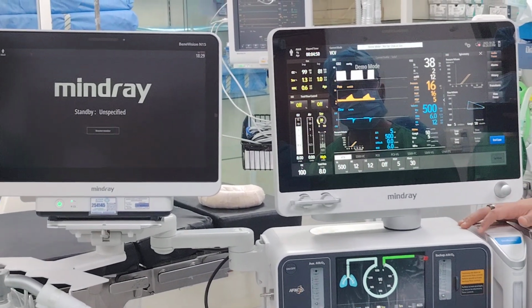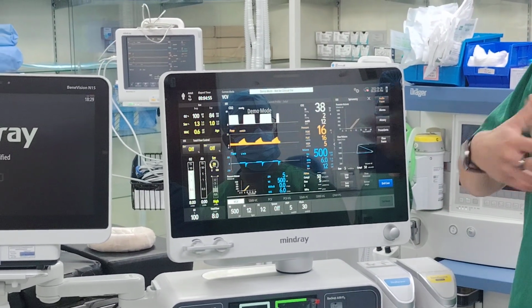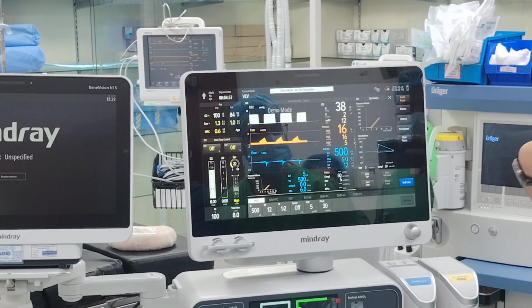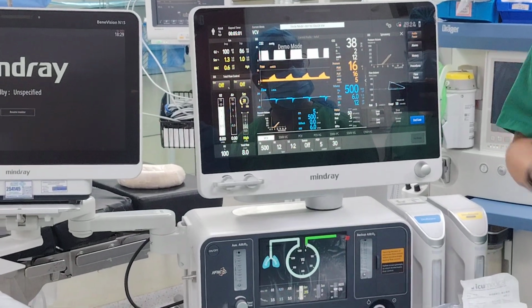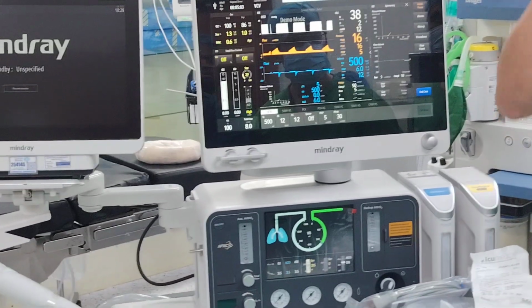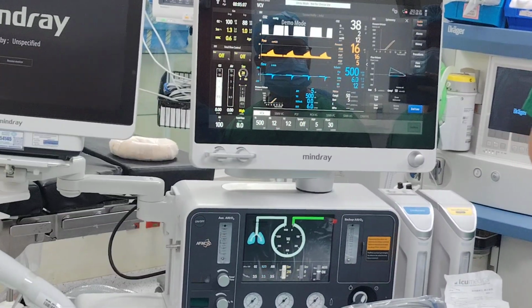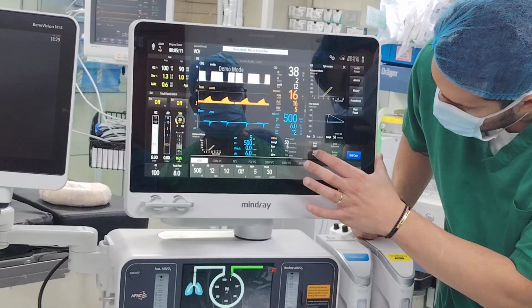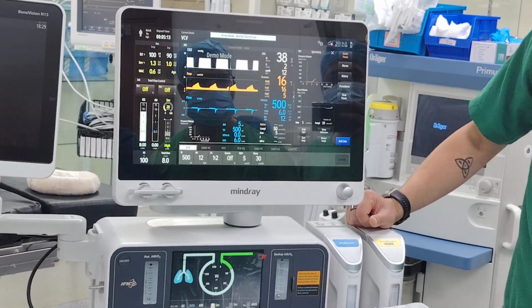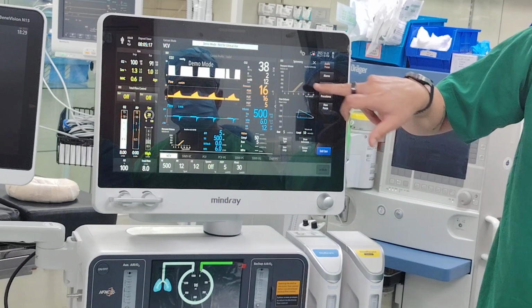Usually, as you know, as an anesthesiologist, before you extubate, it's always best to keep the lungs how they were. If my lungs are open, my compliance is 60. Throughout the GA, maybe my compliance goes down to 30. If you extubate me on 30, the risk of pulmonary complication will increase. But how do you know the baseline? Very simple, you take a picture. Look, save loop. You wait a little bit. Show reference. Now look, baseline.